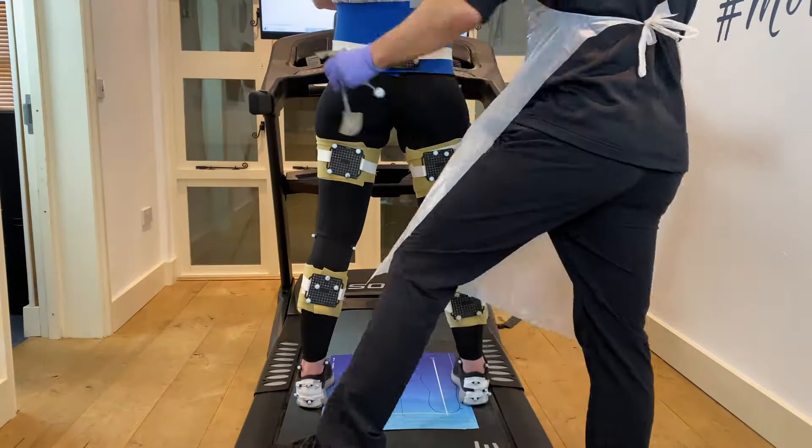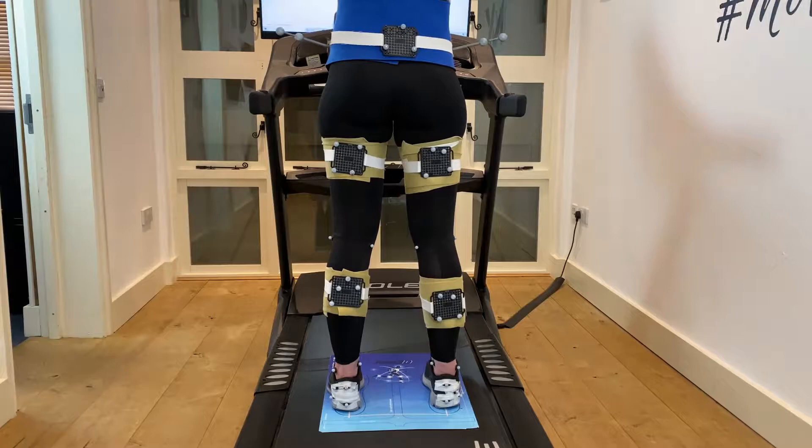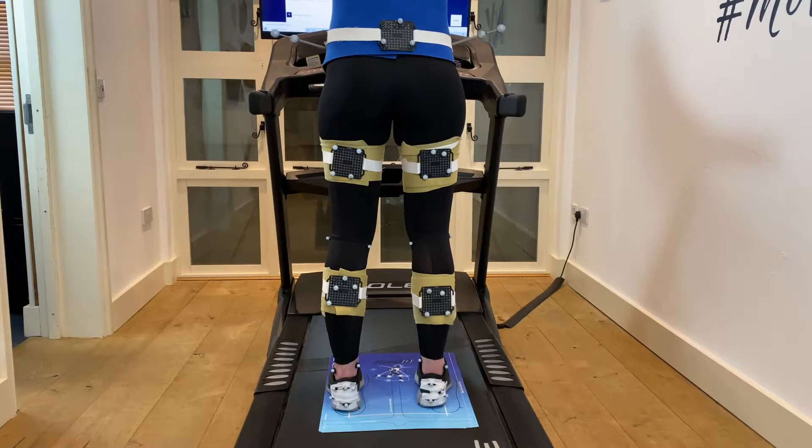Once we've applied the markers we do our calibration, which tells the cameras that we are now just looking for this setup. The whole camera system is then personalized to that individual and the marker setup.